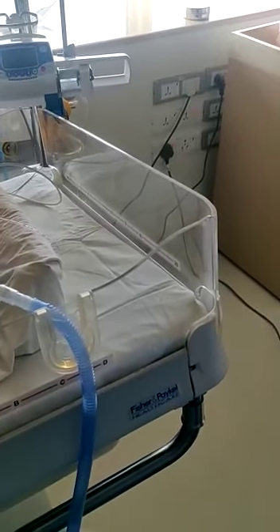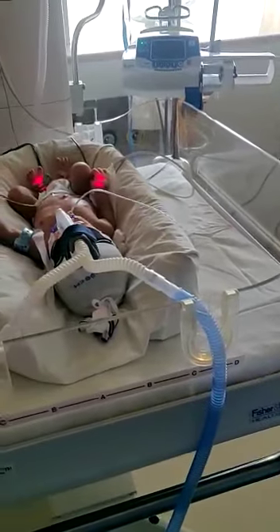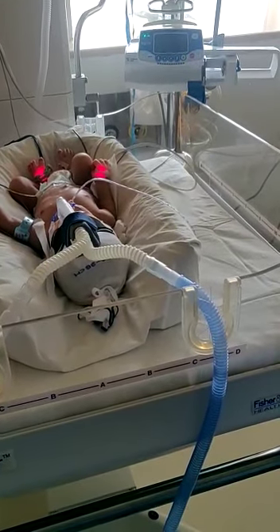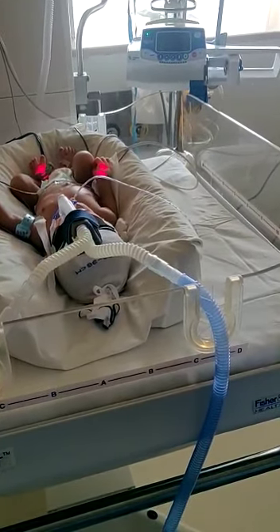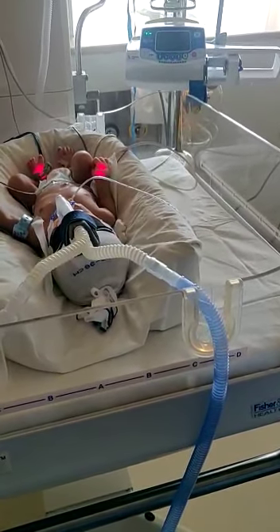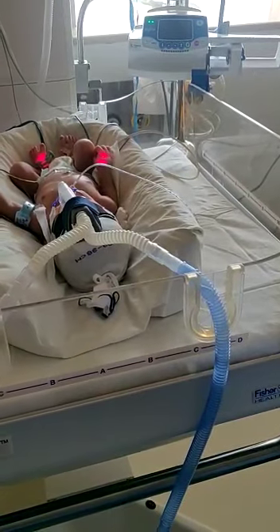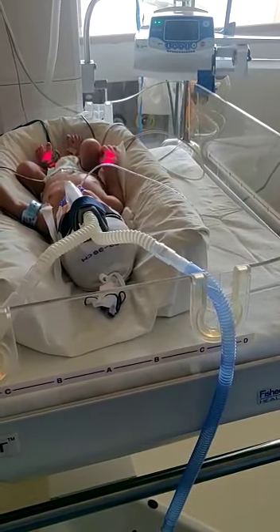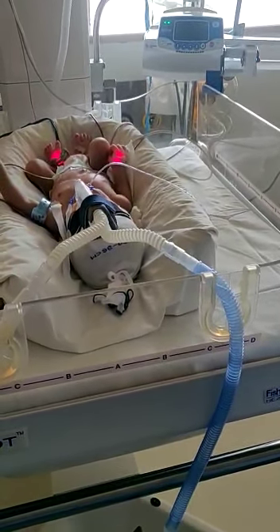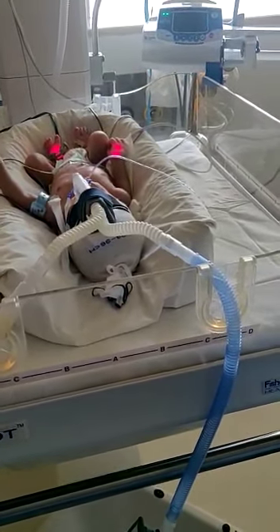This baby was not improving with high dose of prostaglandin, so the plan was to perform balloon atrial septostomy. The baby was shifted to the cath lab within three hours, and the balloon atrial septostomy was performed.